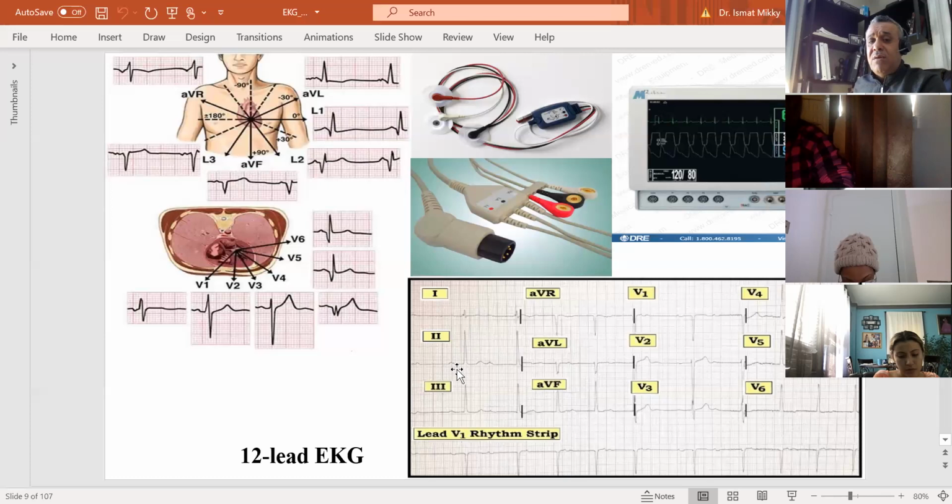So the entire cycle is nicely presented, and the contour of each segment, P wave, QRS, T, is nicely presented on the EKG or ECG strip. From now on, anytime you have a one lead analysis, it will be lead 2.